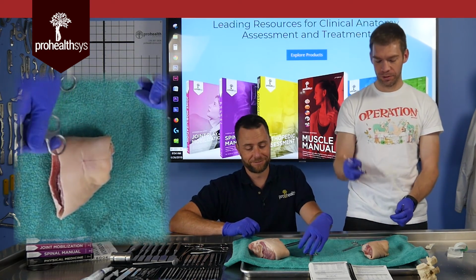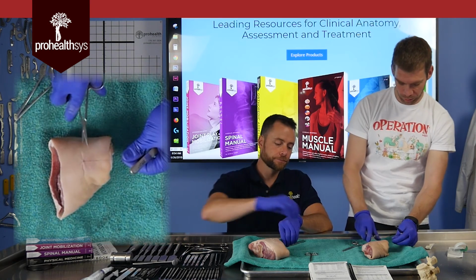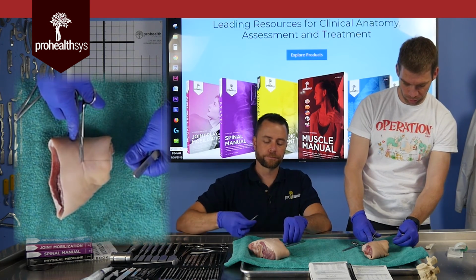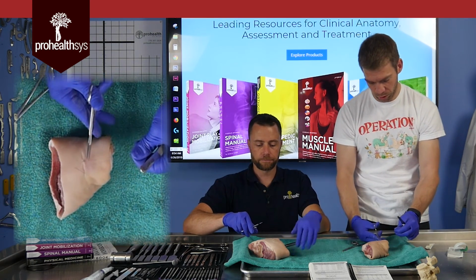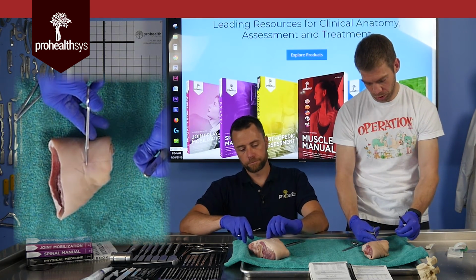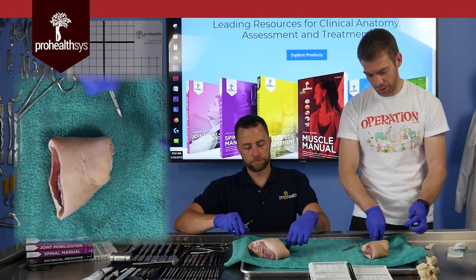Okay. Your last tool, your scissors. What are you going to do? Cut thread with them. How much thread do you want to leave? Oh, I don't know, about 3 millimeters. Any more than that's too much. There. So then you've got a knot that looks okay.